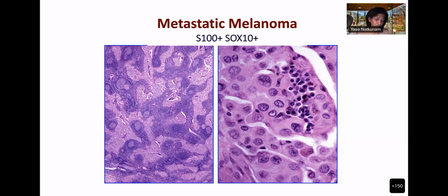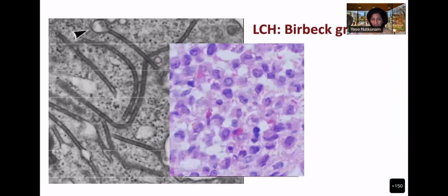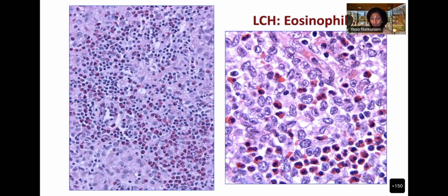If you do see a typical LCH lesion, just make sure you have either the BRAF stain or the mutational analysis, which we tend to do now for confirmation. You don't need those to make a diagnosis. If it is a very limited biopsy or a localized site, just make sure to get a radiologic correlation. In this diagnosis, the radiology is fantastic and the correlation almost confirms it for you. Bone radiology is much better, of course, when you have bony lesions, but you can get the imaging and staging information to make that diagnosis.